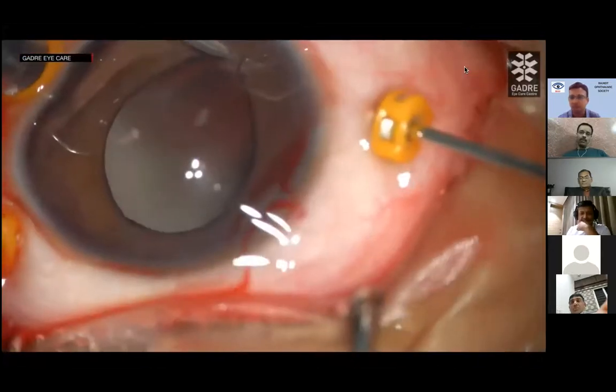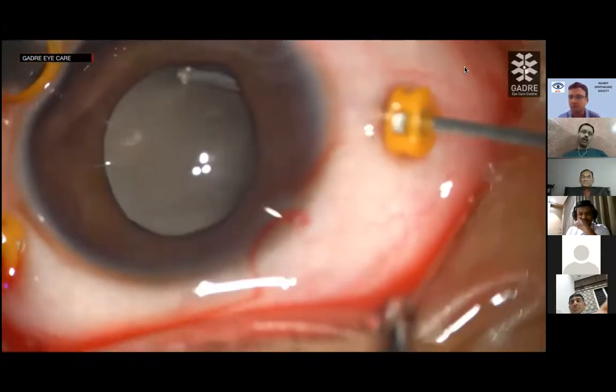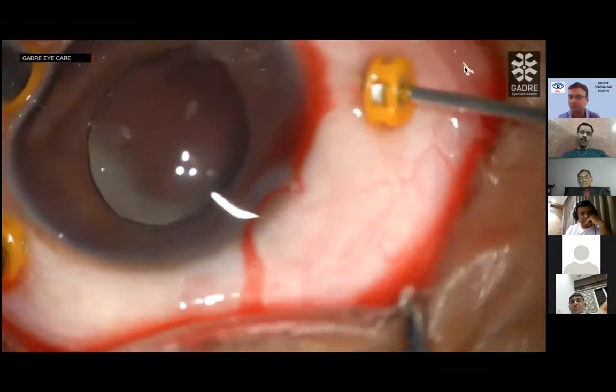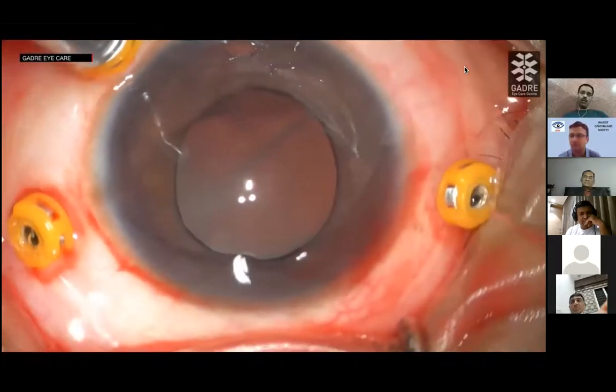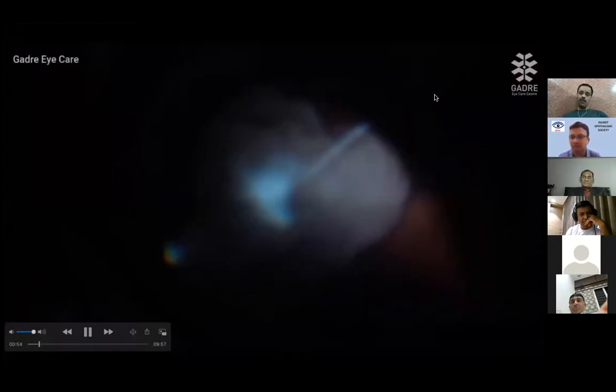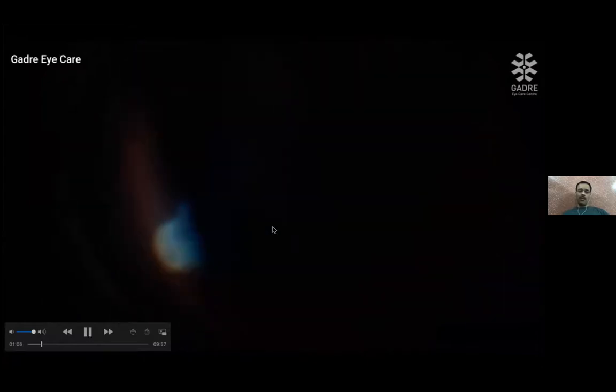I again did an inferior PI, planning silicone oil tamponade in the post-op period so as to prevent any inverse pupillary block, and then proceeded with the vitreoretinal component of the surgery. As you can see, this is a highly advanced PVR and the periphery is full of bare choroid with some tessellations. This cabbage-like or rosebud-like thing is just the amount of retina that's left.